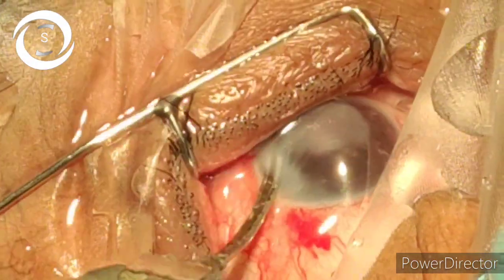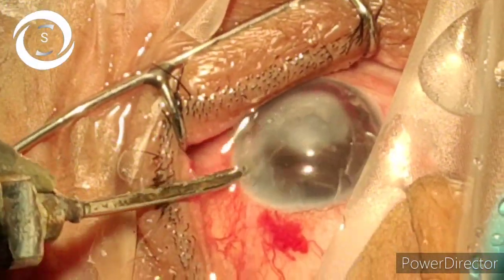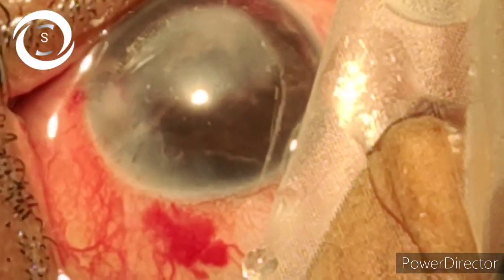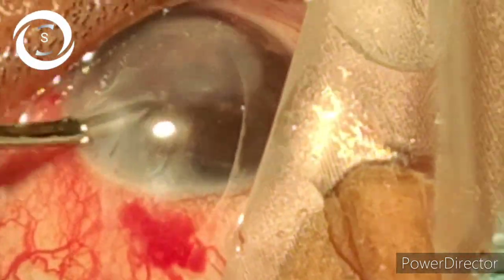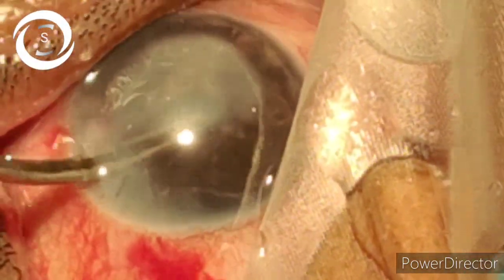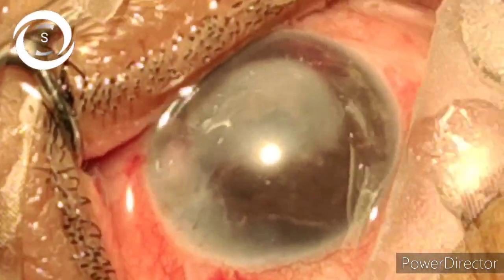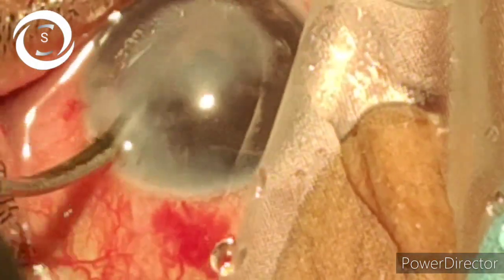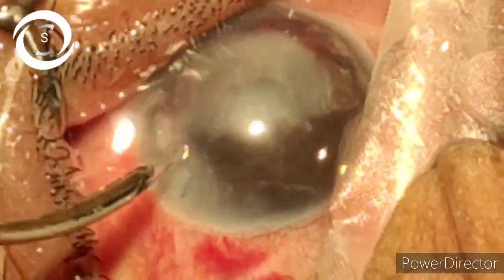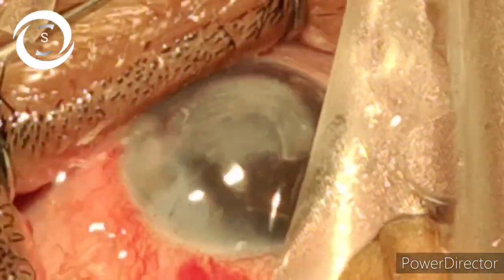Because now I have cleared the anterior chamber, but at the pupil I am slowly sucking the material. Because the patient is phakic, make sure you don't damage the lens, but also go under the iris and remove as much exudate as possible. That way, when we clear the anterior segment and then give the topical, subconjunctival, and systemic antifungals, it works — because the eye responds to the treatment very well.